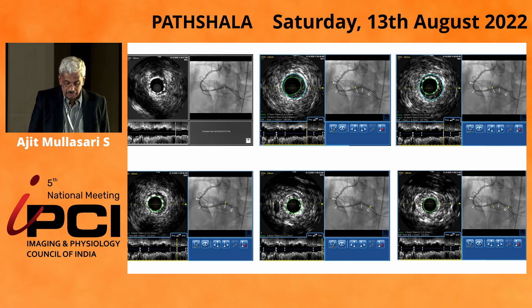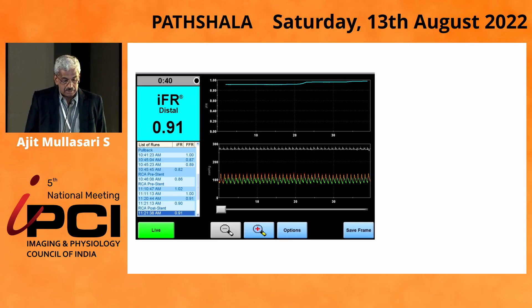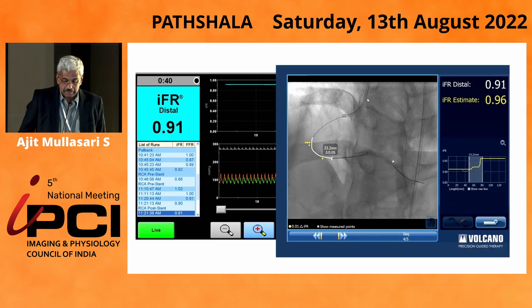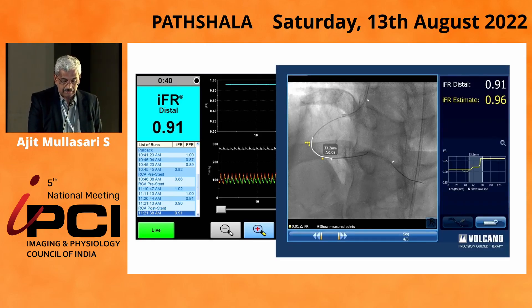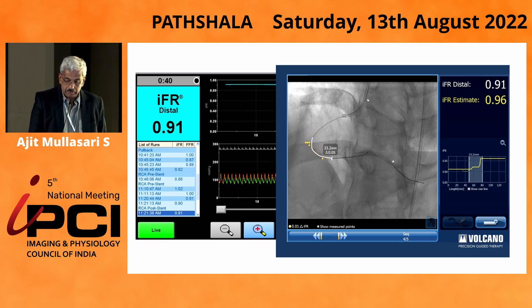The next issue is now we pull back the IFR, and you can see the IFR has changed. It's 0.91 now after we have fixed the stent. And clearly, now the deltas are coming here — your problem has moved from here to here.